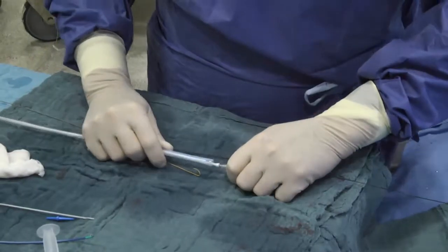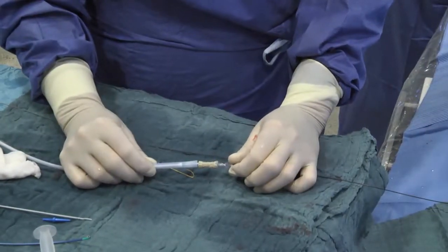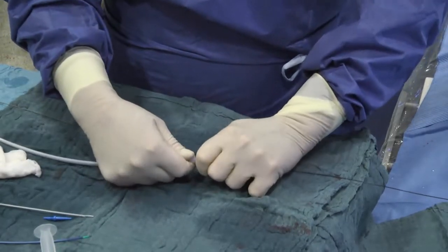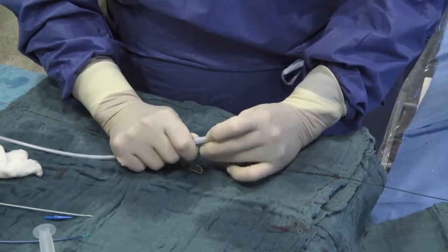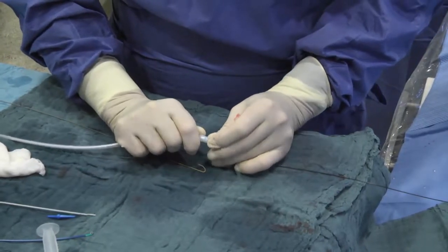I still need to make my angio, but okay. So you see there is quite a mismatch over here, and so we will have to push. Push, and this is actually the hardest part of the whole catheterization, getting this in there.